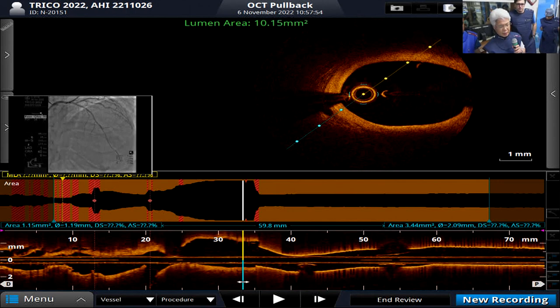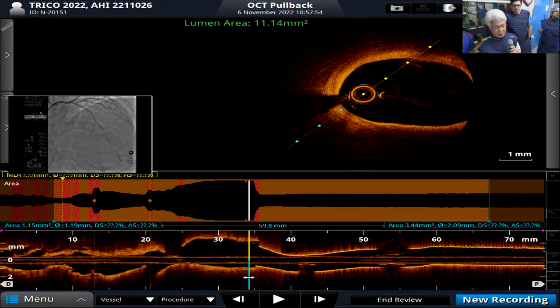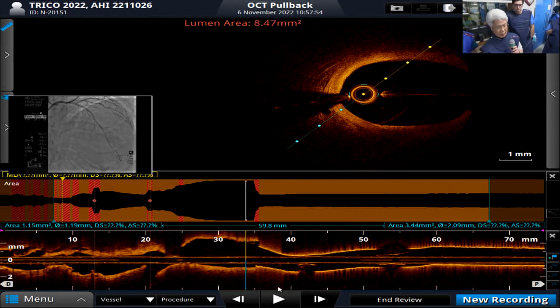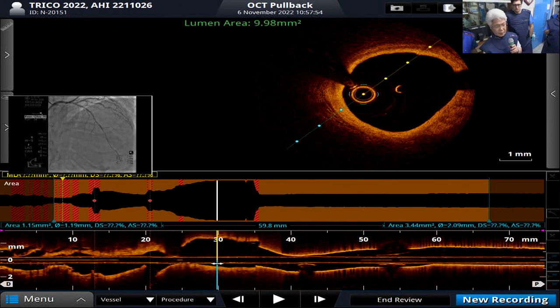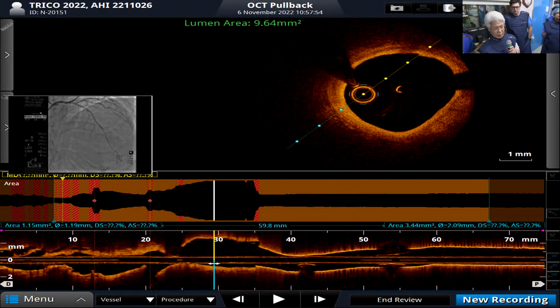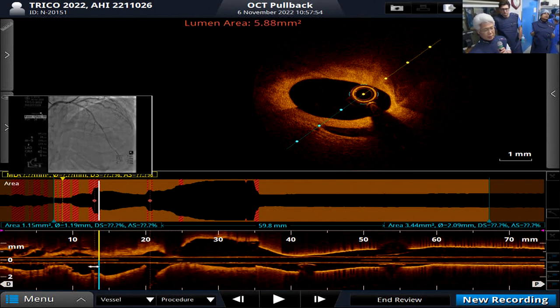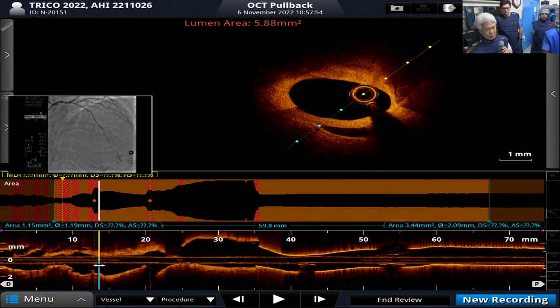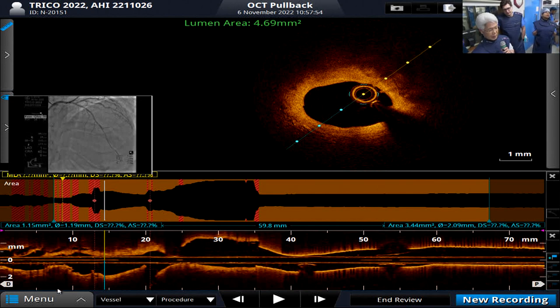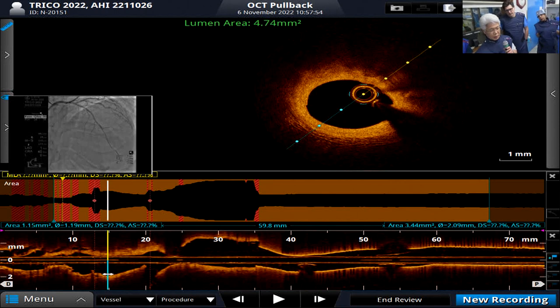As you said, I'm not sure, yes, some disease at the orifice in this case. We are not sure about the pure orifice, right? And what's the plan for that long dissection? We're going to stent the whole thing down? From here the dissection starts, right? Or I would still have some dissection up to the dissected portion. Here you can see some space, right?